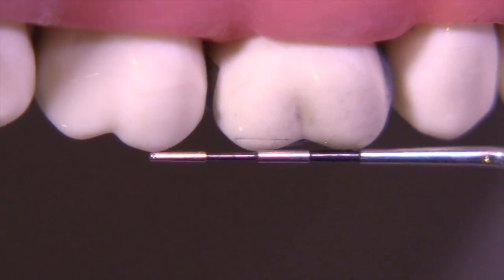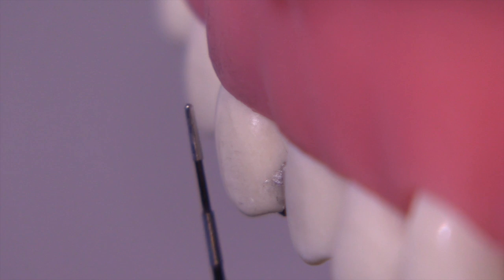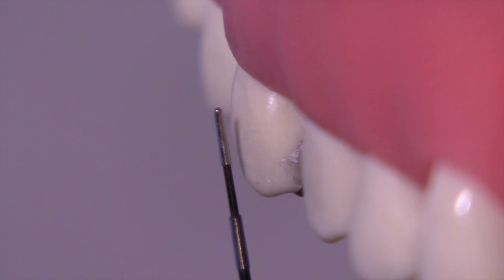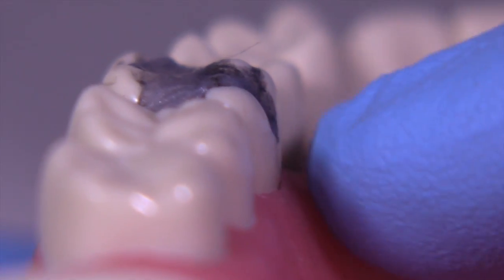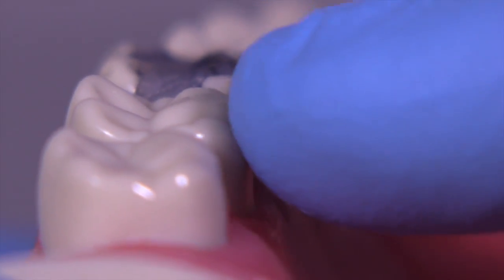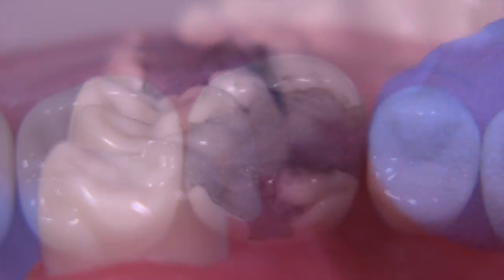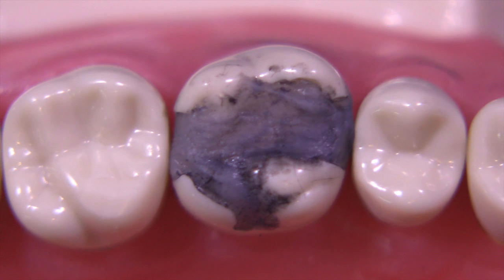Spend a minute or so taking some measurements - some people even write these down. Looking from the side, if we're going to reduce a facial cusp, we don't want it sticking out facially; we want it to tuck in like a natural tooth. You can use the adjacent tooth as a guide to carve your amalgam so it doesn't blossom outward but tucks in. The same applies to the lingual side - if we're replacing the distal lingual cusp, we want it to curve back in towards the tooth.